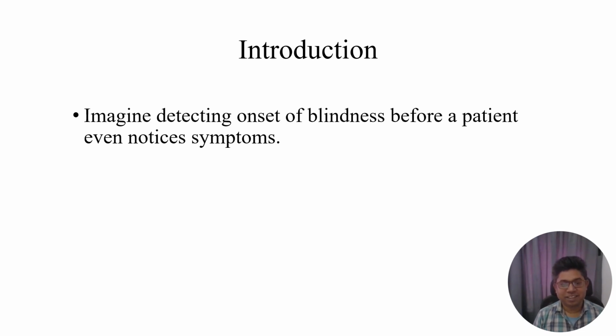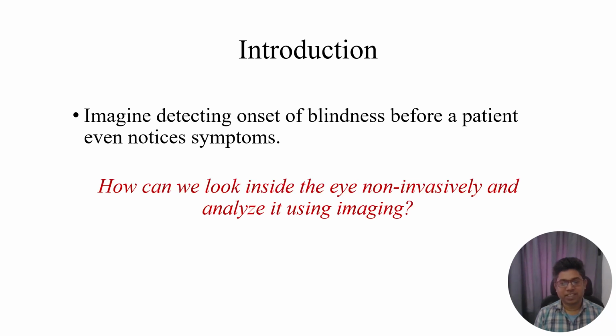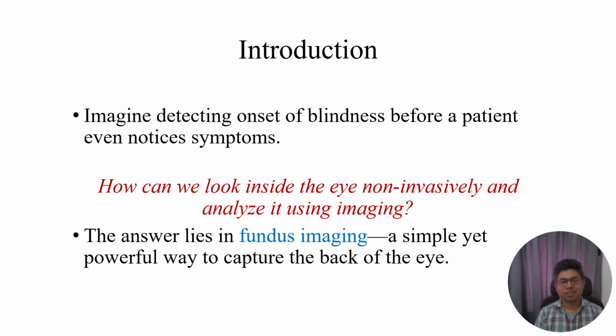So imagine that you want to detect the onset of blindness before a patient even notices any symptoms of blindness. So the question is, how can we look inside the eye non-invasively and analyze it using some form of imaging? The answer to this question is fundus imaging. Fundus imaging is a simple yet very powerful way to capture the back of the eye.